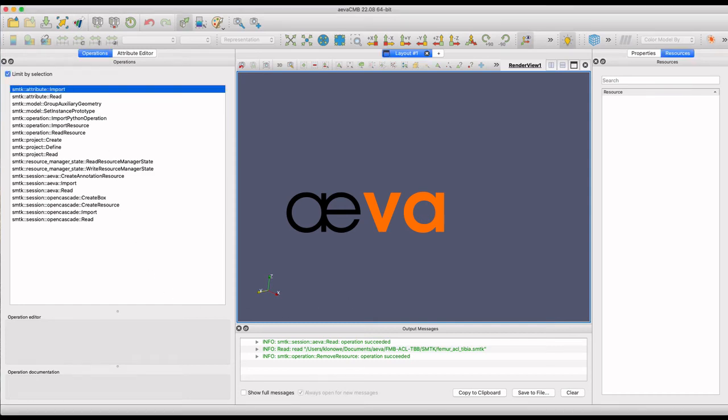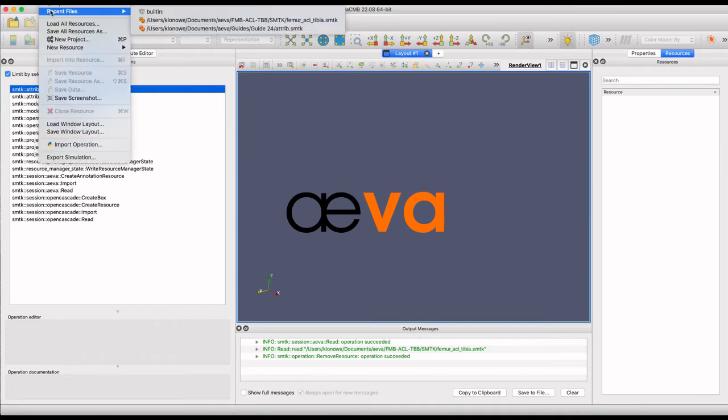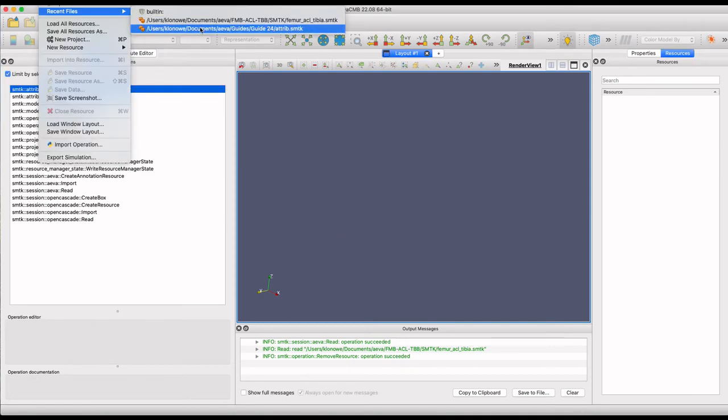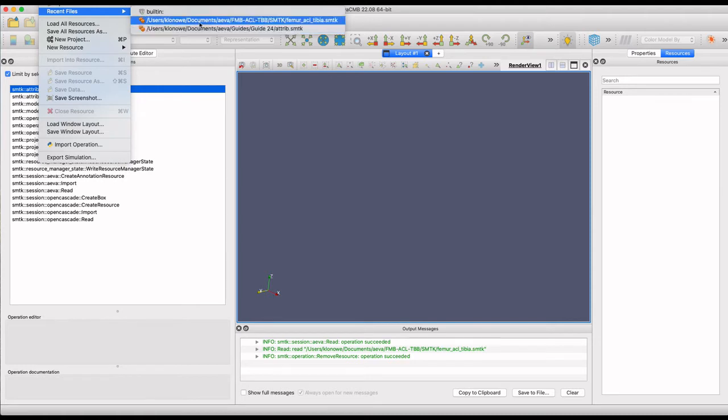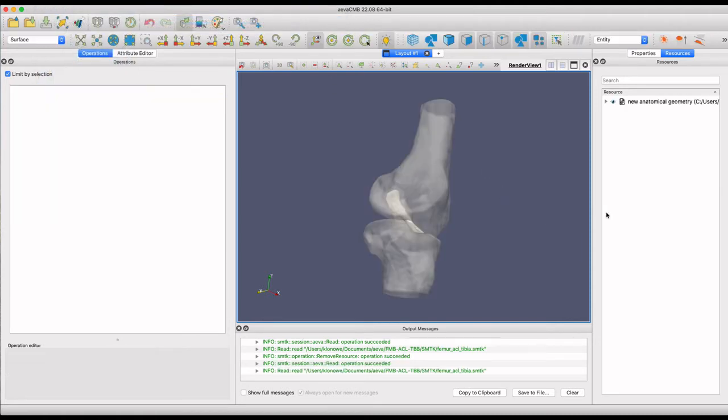This video will show how to assign annotations to an anatomical geometry resource using AvaCMB.